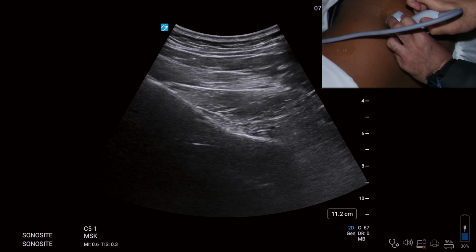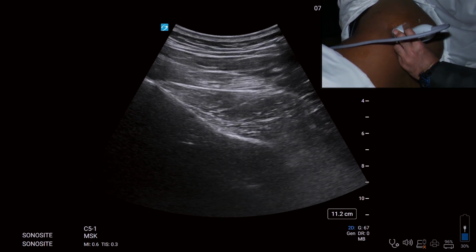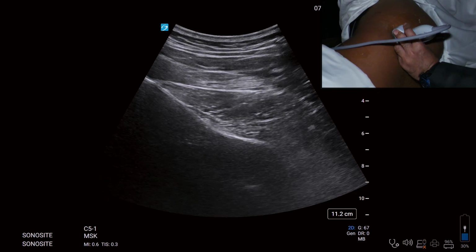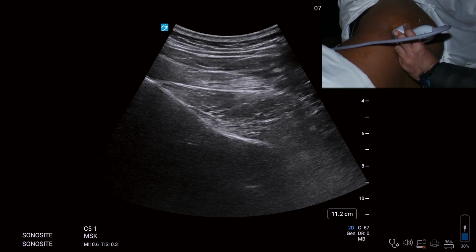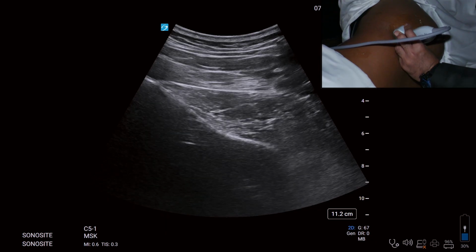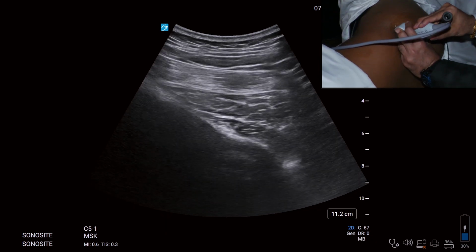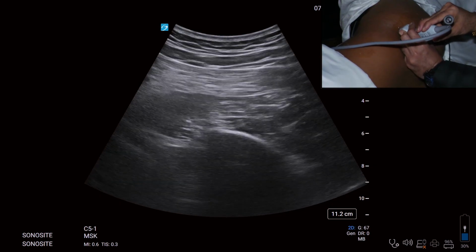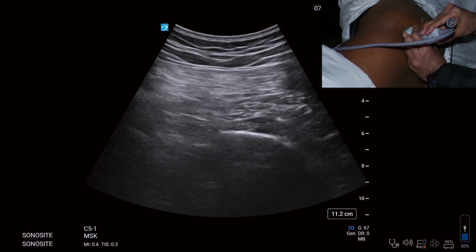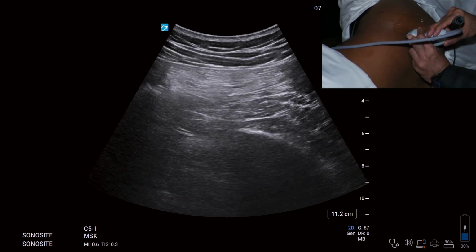Okay. Again, the same picture. Can you see the ala of the ilium? Like a mountain, on top of that gluteus maximus, medius, minimus, a pulsation seen. Next step is again, I'll try to move caudally to identify the break. So I'm moving caudally, my dear friends. Can you identify? I have moved caudally, okay? So slight caudal tilt is going to help.